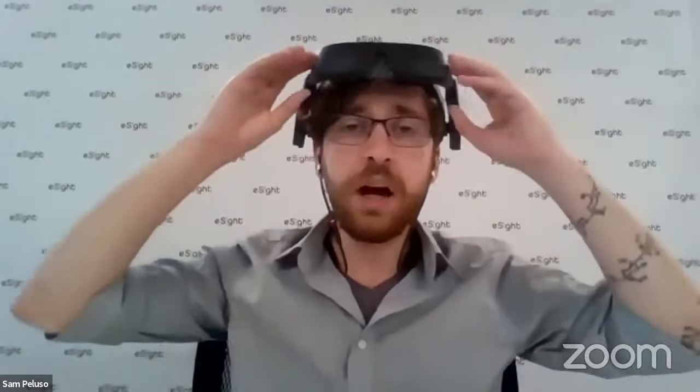We do have a question here from Nitesh who asks, does any part of the device, including the battery, get warm with extended usage? It does generate a little bit of heat because there's a camera that's on all the time. So it's just like your phone. If you open your phone and leave the camera on for 30 minutes, your phone's going to get pretty warm too.